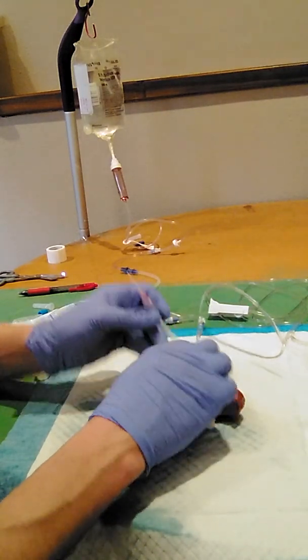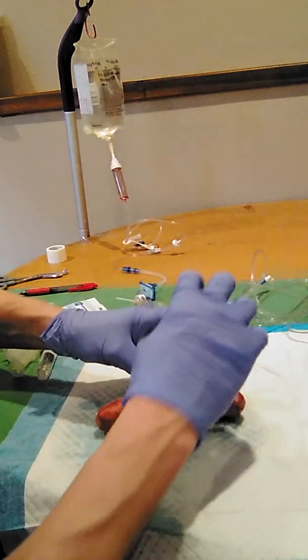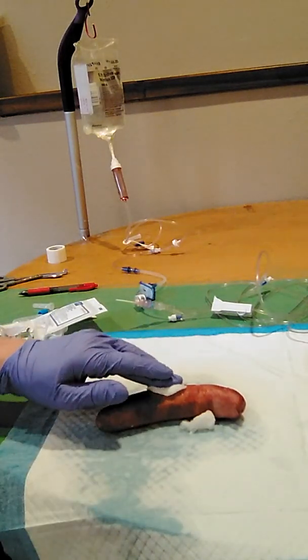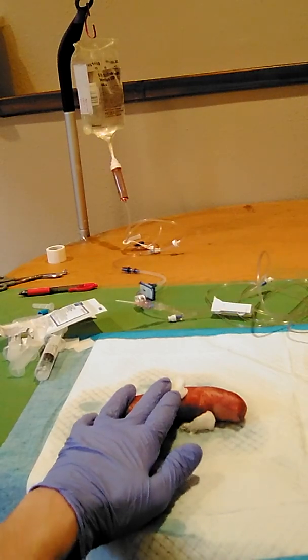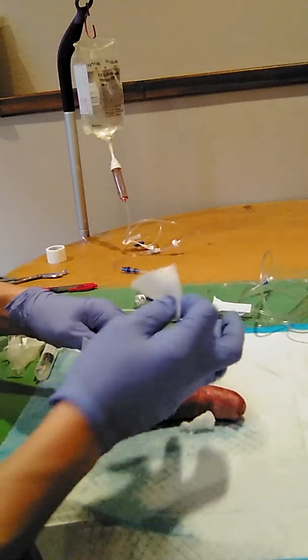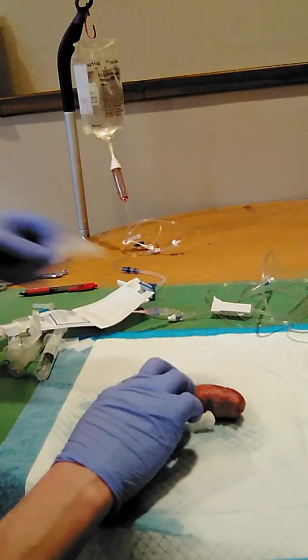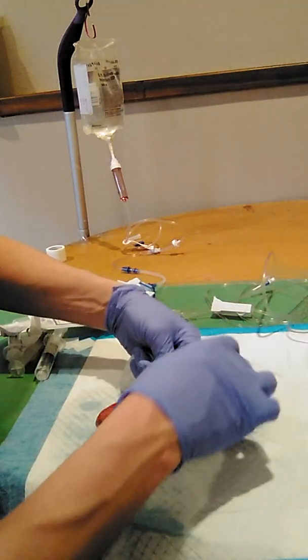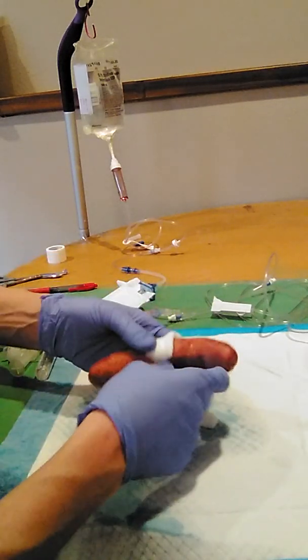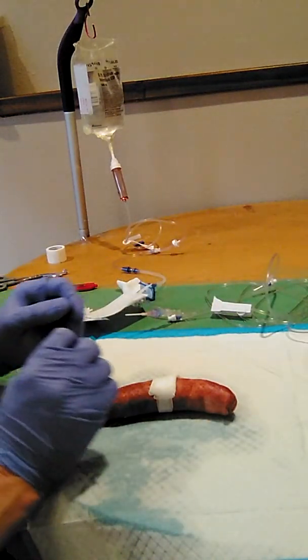So that's waiting for this. This gauze is doing its work. So I have a sterile dressing here. I'm going to put over that. And I'm going to apply this tape to maintain pressure on the dressing so that the patient can heal.